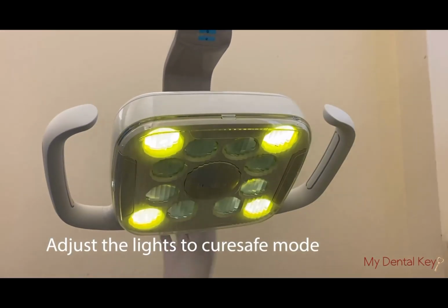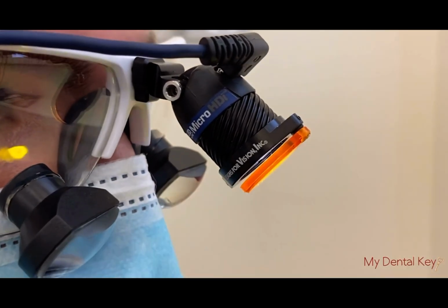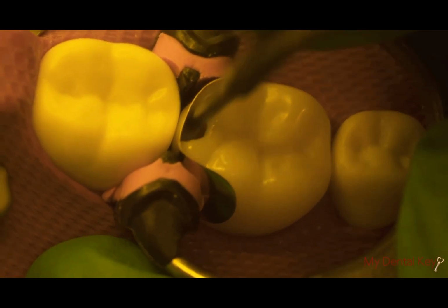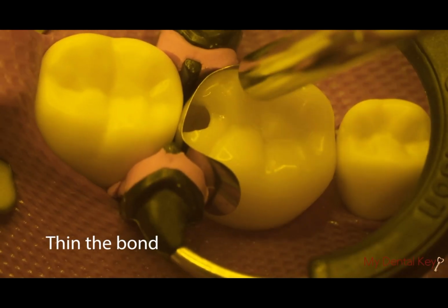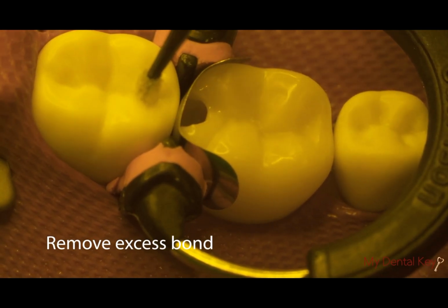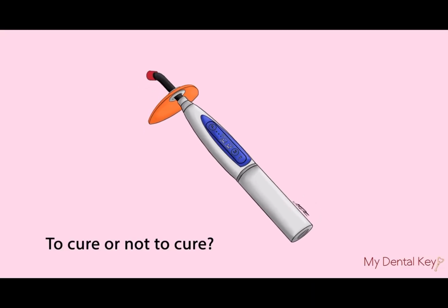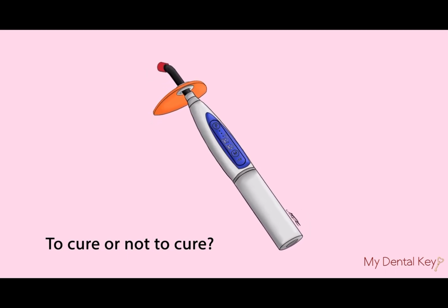Adjust the overhead light and loop light to cure safe mode. Scrub the bonding agent into the preparation using a microbrush. Apply a light stream of air from the air water syringe to thin the bonding agent. Using a clean microbrush, you may remove the excess bond that has spread beyond the preparation. In a clinical setting, you would now cure the bond after applying the bond and removing the excess.